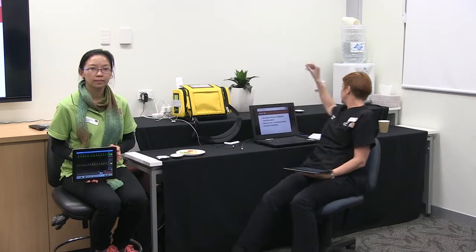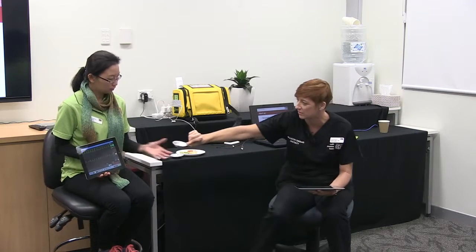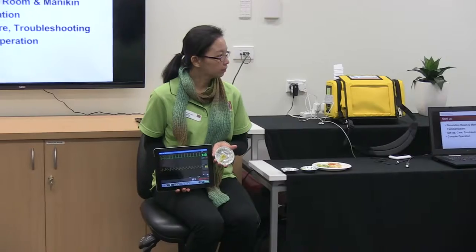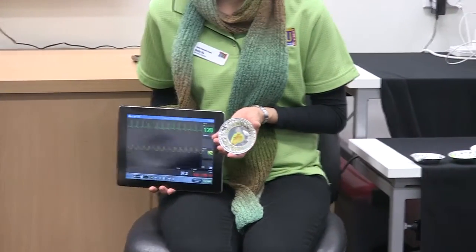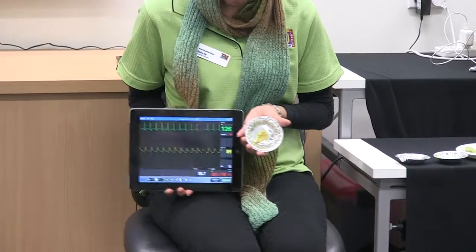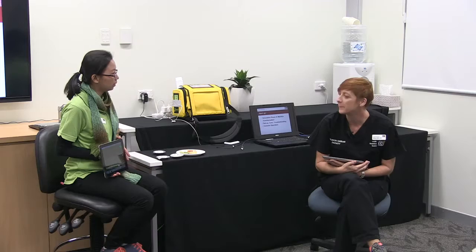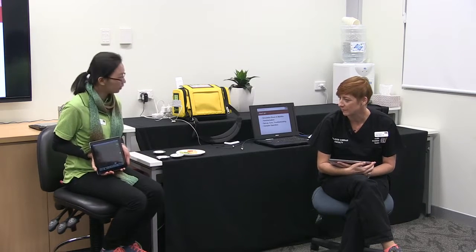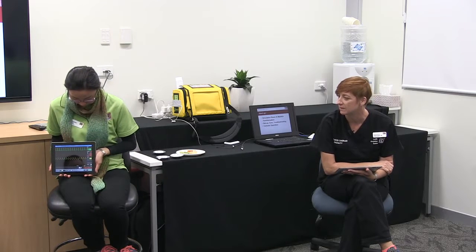Later on that night she starts coughing up bloodstained sputum and has increased chest pain. The doctor said he'd come but he was a little bit busy. Looking at that clinical picture — the sats have really dropped, and the respiration and BP have dropped as well. So does that make sense? You can just do a very quick sort of talk-through with a tiny bit of moulage.